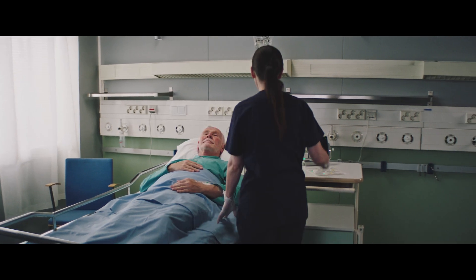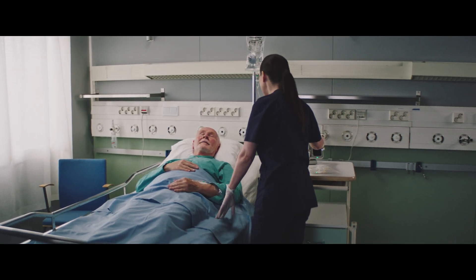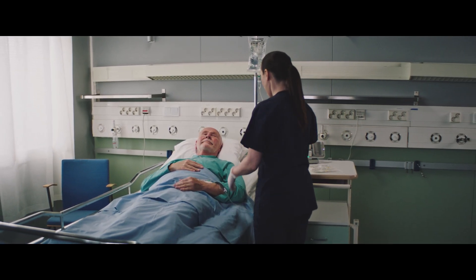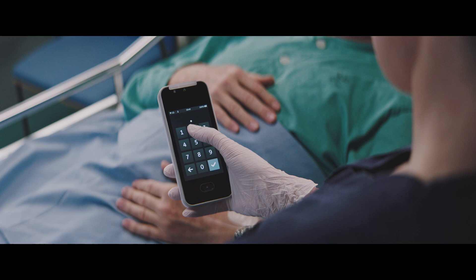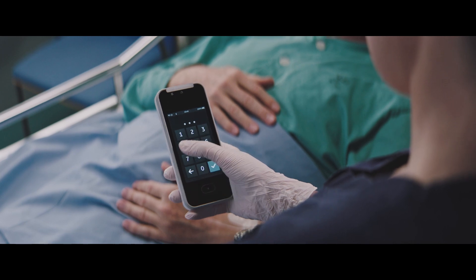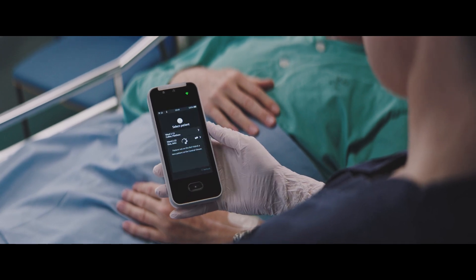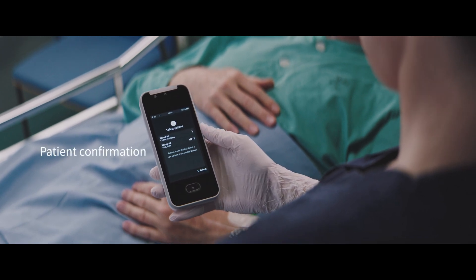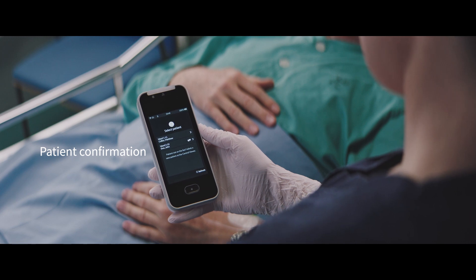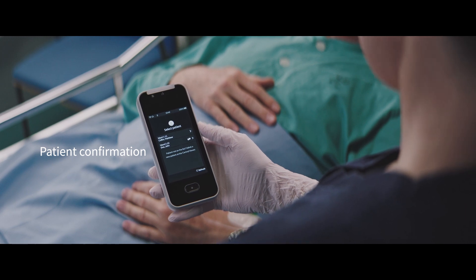At the patient's bedside, the nurse picks up the monitor, enters a code to unlock the device, then selects the correct patient from the list. During this process, the nurse confirms positive patient identification.